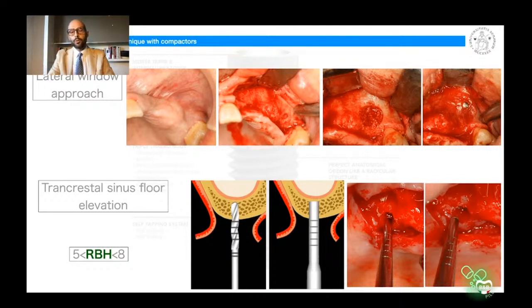And thereafter, with the progression of specific tools defined as osteotomes, by a process of malleting, we elevate the sinus floor by the intrusion of the osteotomy procedure that elevates the sinus membrane, creating a sort of tent space. This provides a space for the blood clot to mature, and according to the residual bony crest that helps us reach adequate implant primary stability, we can leave the implant partially within this blood clot and wait between 4 and 6 months before loading.